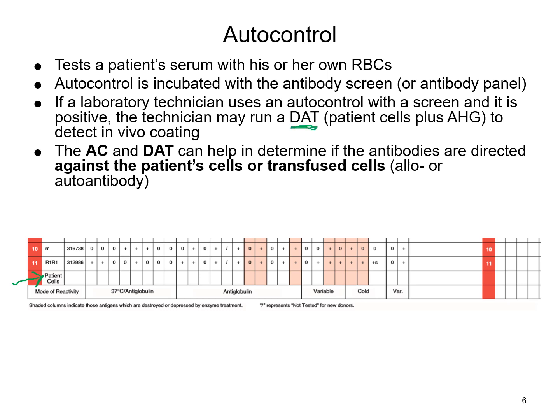Well, the DAT is basically your patient's red cells tested against AHG, or anti-human globulin. Your patient red cells are going to be washed, removing anything unbound, adding that AHG, and then you're looking to see if those cells have been coated in vivo within the patient by any sort of antibody that's causing those cells to self-agglutinate. Now, most places when they do a DAT, they will do a poly-DAT, which is going to look for any sort of IgG coating as well as C3.